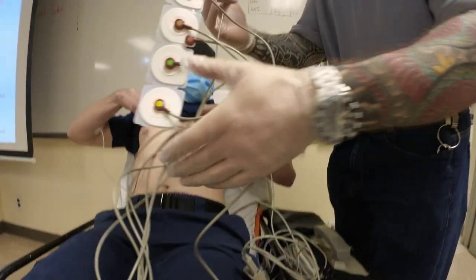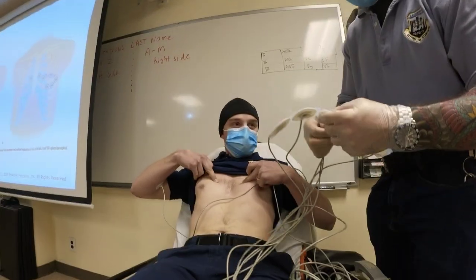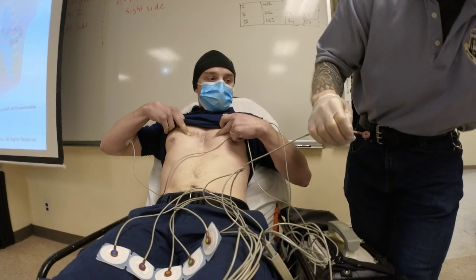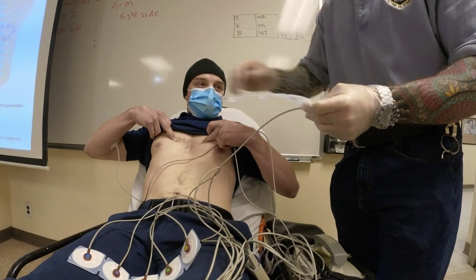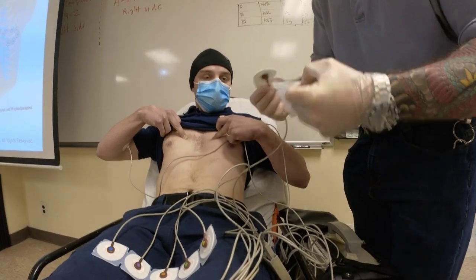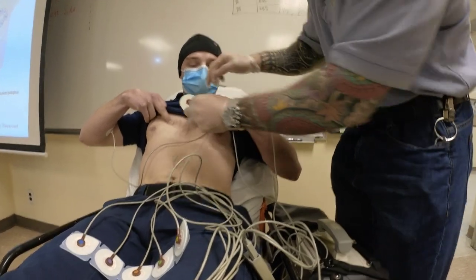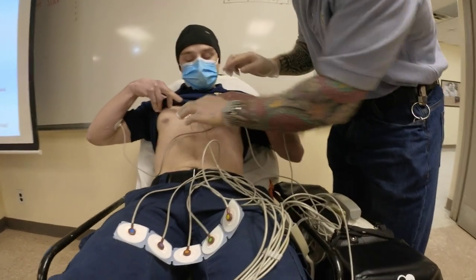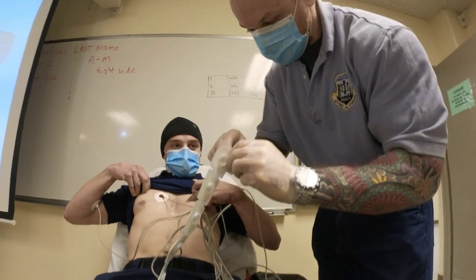And you want to palpate. If your patient is very obese, it'll be a little bit harder to do. If your patient is very skinny or has COPD, you'll see very good prominent intercostals. So it might be easier, right? So we cleanse the skin, right? We told the patient what we're going to do. So we're going to start with V1. Move your finger. Then, V1 goes first, V2 goes next.